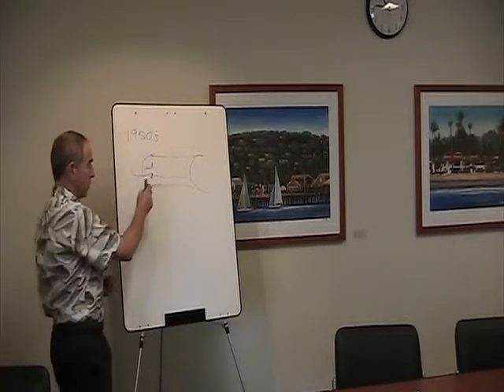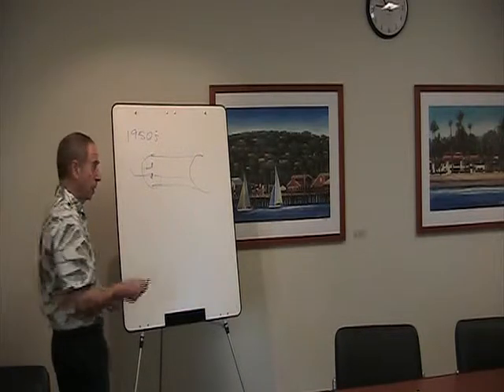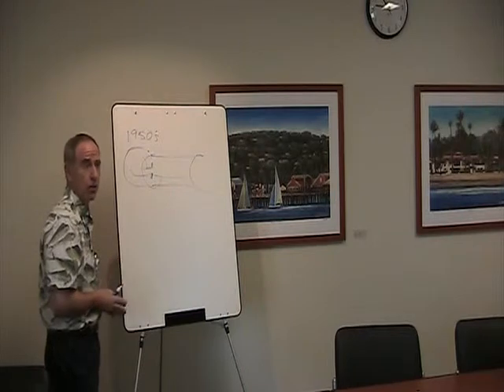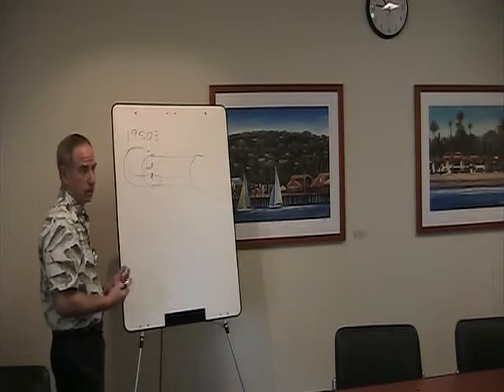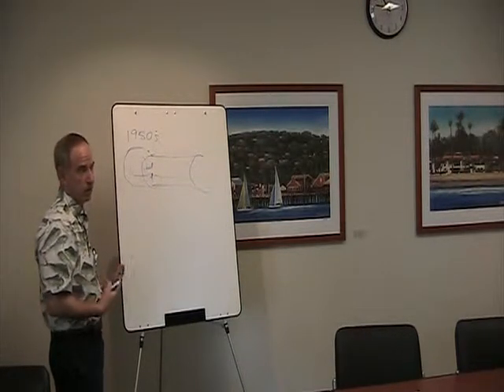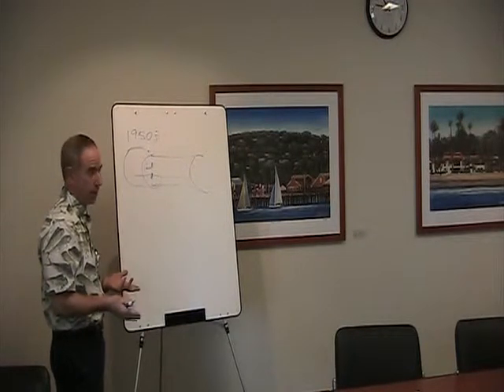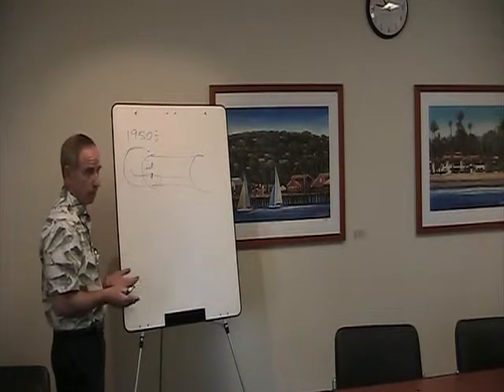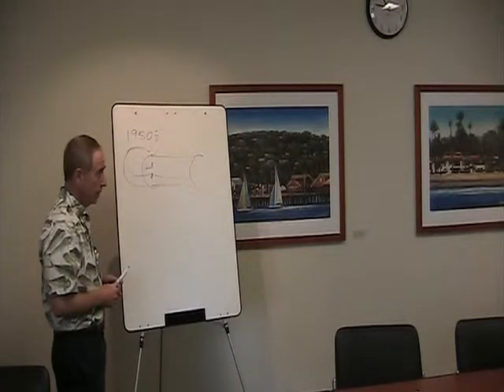So it worked really well. If patients developed pneumonia or other intrinsic lung problems, they could put a hood over the patient and give them oxygen through that. So that worked pretty well too. But if they got really severe lung disease, it really didn't ventilate people very effectively. Okay, so it was a great device, and it saved hundreds of thousands of lives probably worldwide during the polio epidemic.